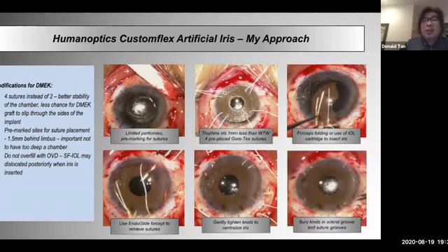And then once that happens, you tie the knots, you rotate the knots, and I usually cover up the incisions, and I'll show that in the video, and that's the procedure. It's important not to overfill the chamber with viscoelastic before you insert it, because if that IOL is just sitting in the sulcus or is just transsclerally fixated without any sutures, and you put a lot of viscoelastic in, you introduce this bulky iris, you can dislocate the IOL. That would be pretty tragic, okay?